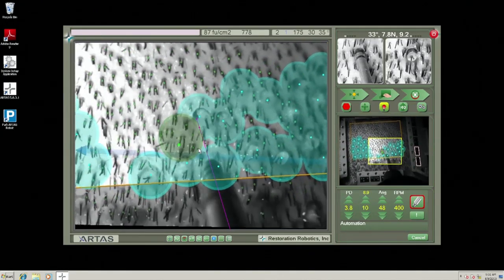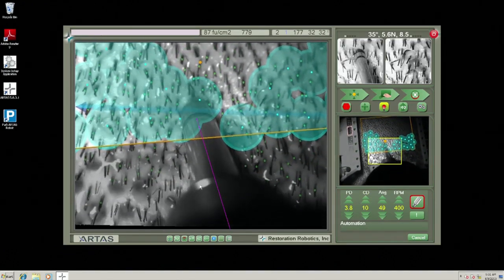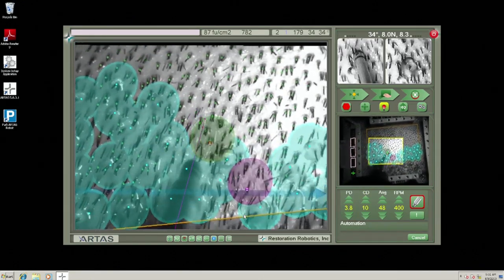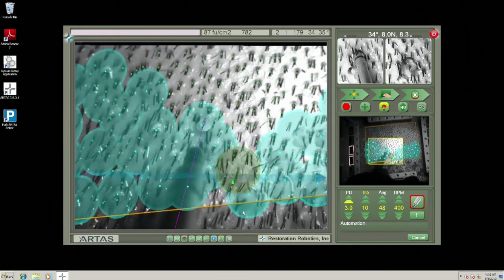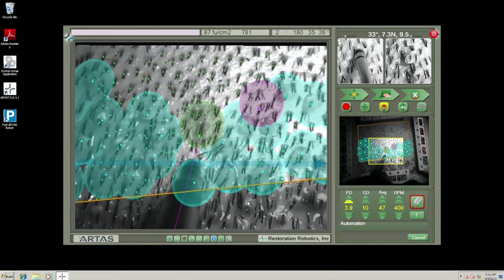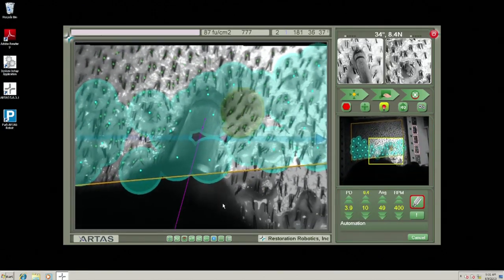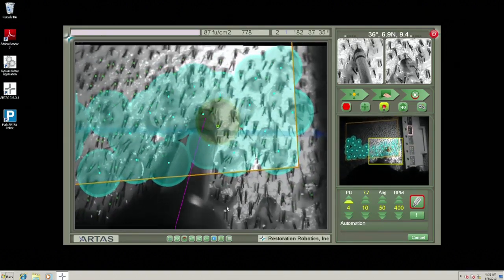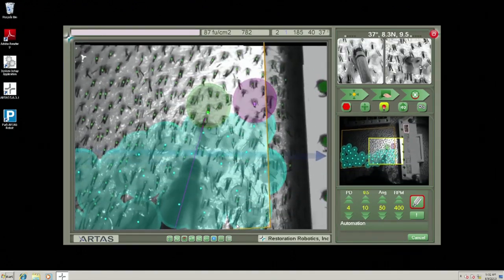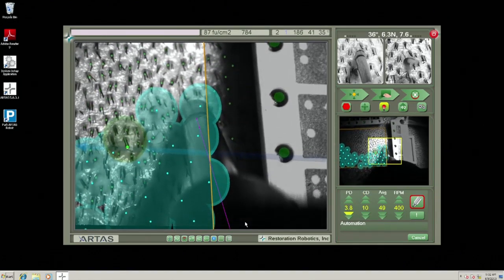I caught the back end of a question regarding what are the advantages of the robot versus a manual or motorized FUE. Was that the question? I'm sorry. Okay. Well, it depends on which human model you compare it to. If your practice is well equipped with different FUE devices, and you're able to routinely extract or dissect 1,100 grafts per hour, and you have multiple patients presenting for your procedures, and you can handle them all at one time, that's great.